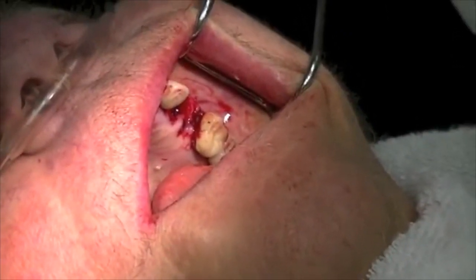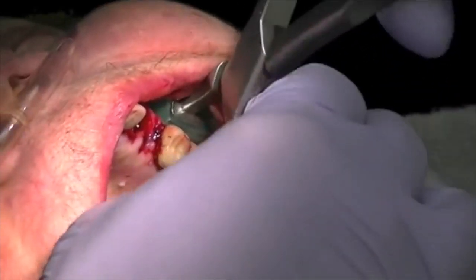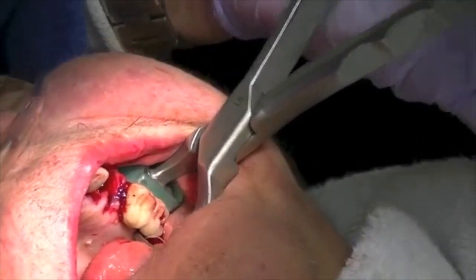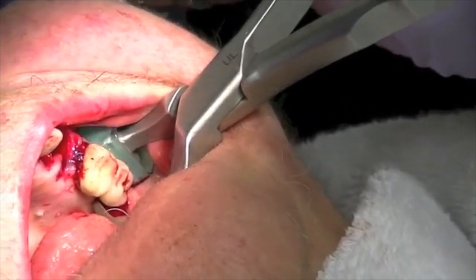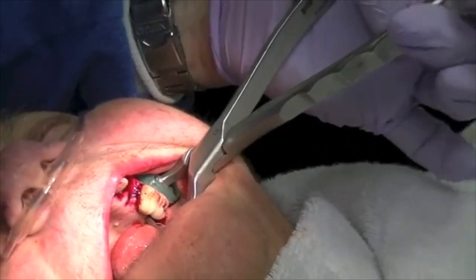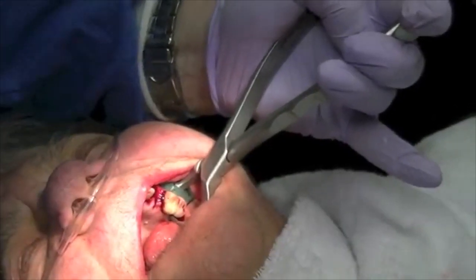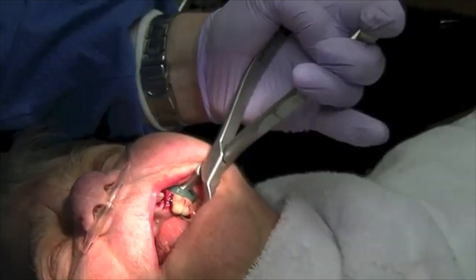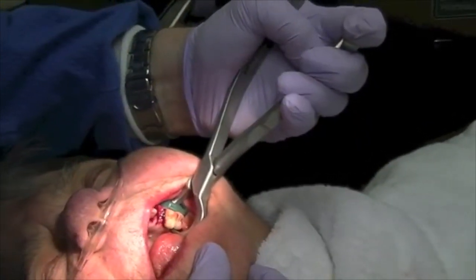Let's take our upper left traditional standard physics forceps and take this second molar out. Using my left hand now — removing a maxillary tooth usually is not so much of a problem because the bone is medullary and relatively soft. I'm rotating my wrist toward the left ear, simply putting constant pressure — not squeezing, just rotating. We all know we have three roots here.